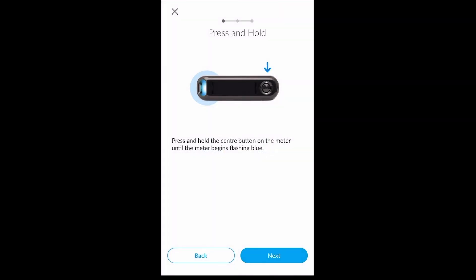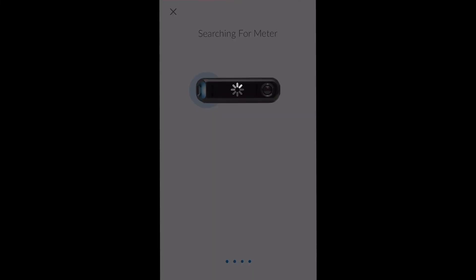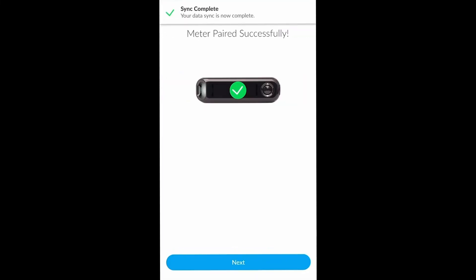Please note that this may also require you to enter a code which may be displayed on the device itself. When done, click next. You will see that the app searches for the meter and will download any results stored within the meter's memory. Once data has been synced from your device to your Gluco app, you will be able to click next.